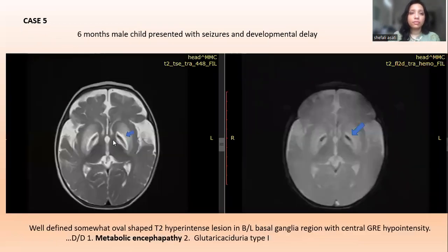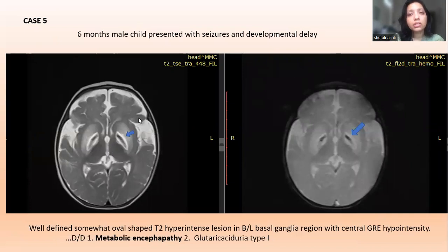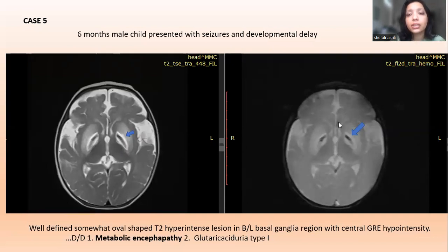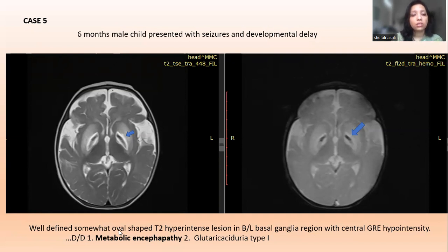Case 5: A six-month-old male child presented with seizures and developmental delay. On T2-weighted imaging, there is a well-defined hyperintensity in the bilateral basal ganglia, and on GRE sequence there is central hypointensity. The differential diagnosis is metabolic encephalopathy.